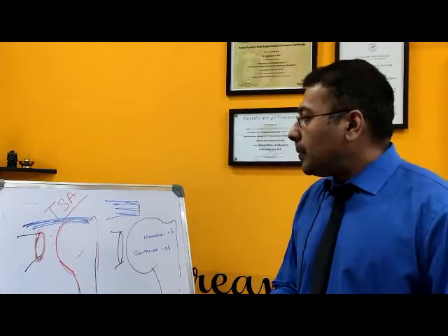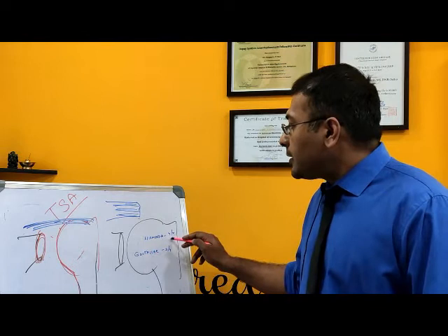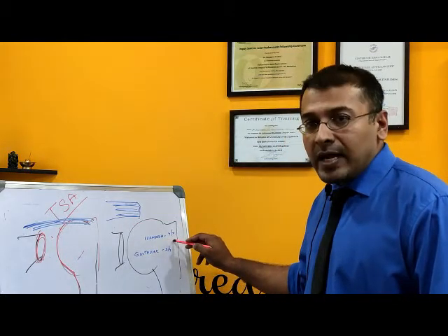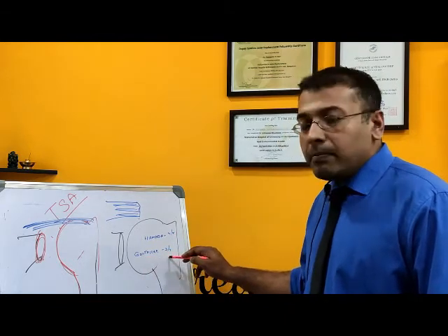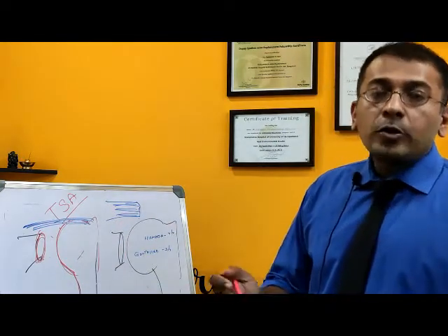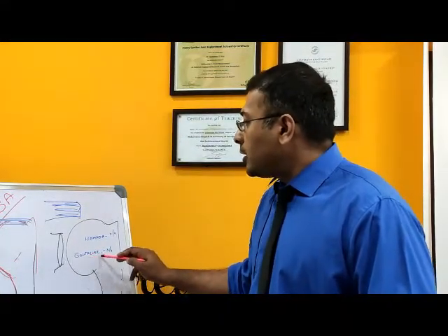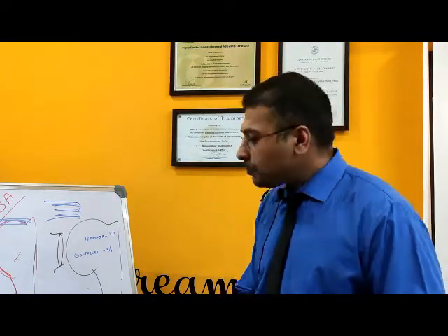Hamada says stages 1 and 2 are less arthritic. If we have a massive muscle tear which can't be repaired, and we have Hamada 4 and 5, which is severe arthritis of the shoulder, with severe fatty infiltration of the muscle, the muscle shrinks and a lot of fat gets deposited in it, which we can see on an MRI. If it is severe fatty infiltration like Goutallier 3 and 4, then we do a reverse shoulder replacement.